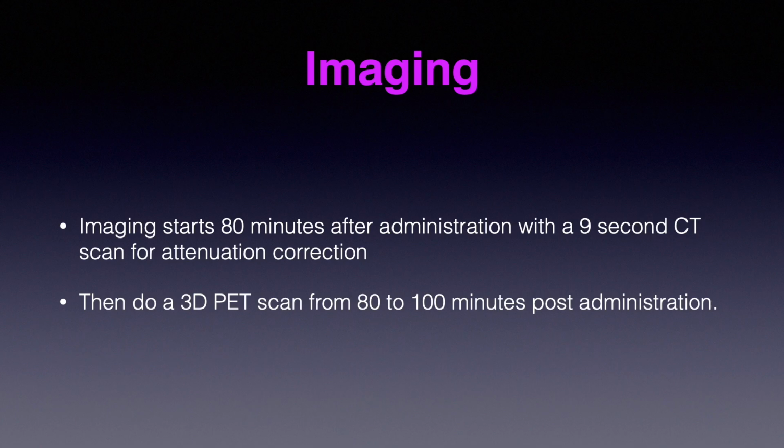Imaging starts 80 minutes after administration with a 9-second CT scan for attenuation correction, and then a 3D PET scan from 80 to 100 minutes post administration of IV F-Dopa is performed.